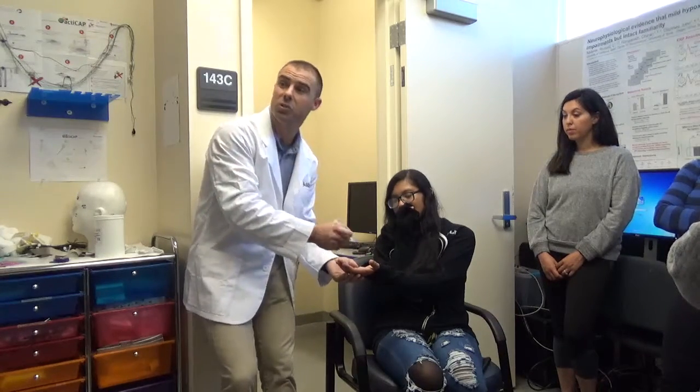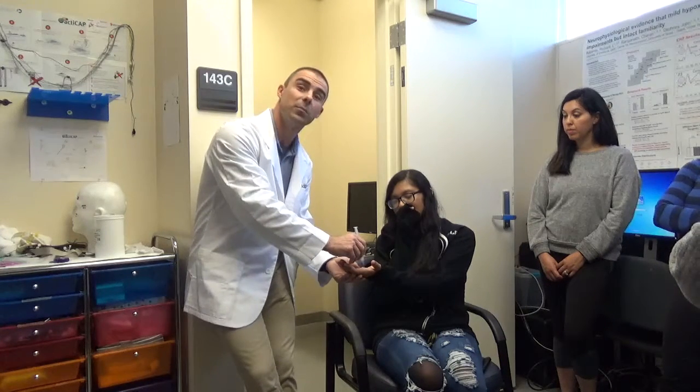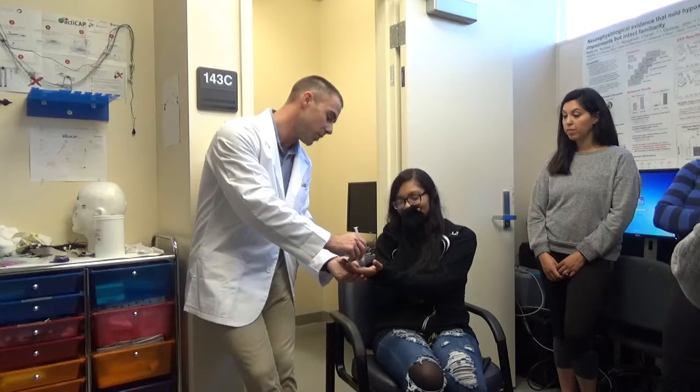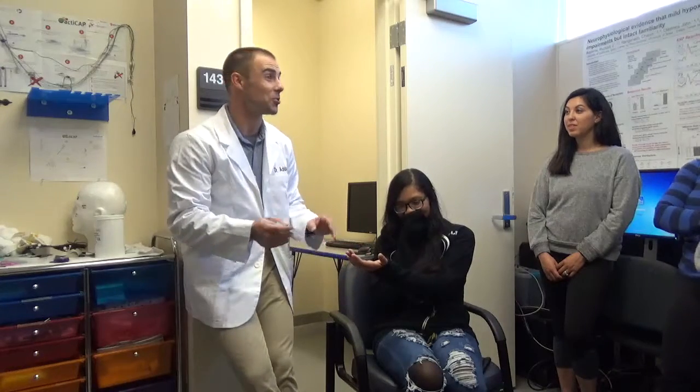And then you also want to show them what we're going to do to exfoliate the skin, which is to basically take the tip of that syringe and we move it around really gently. Is it tickling? Yeah. That's actually pretty good. You want them to know that it should tickle, not hurt. Now here's the thing. It can hurt.